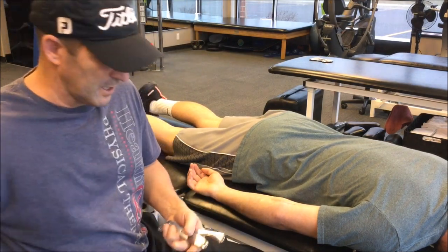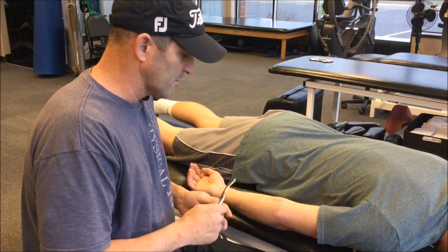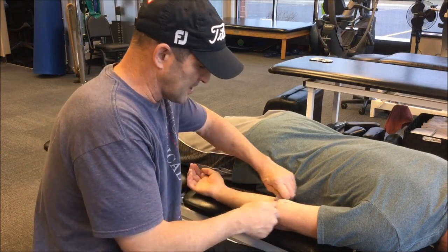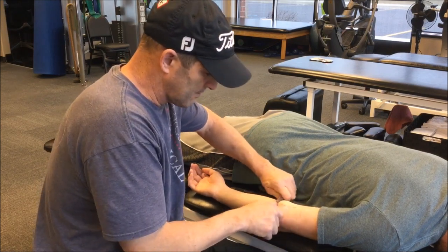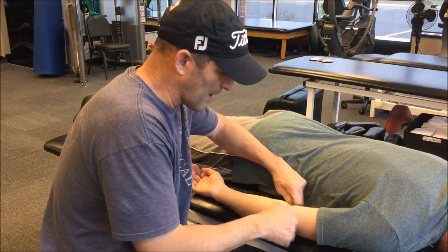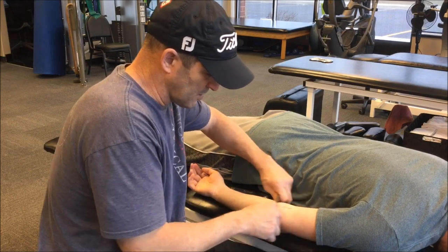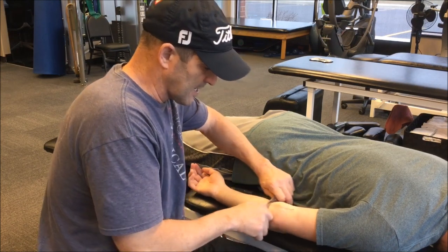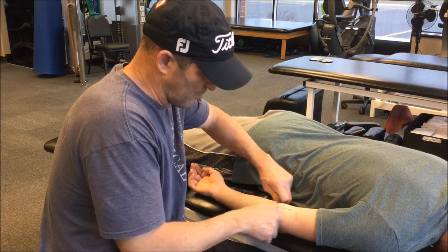Depending on the acuity of the injury, the scar mobility, and what you're trying to accomplish, I'll always start more diffuse. With the contoured Graston tool, I'll take the beveled edge and just start going along the scar lightly to get the athlete used to it, always being careful around bony prominences. The first technique I use is always diffuse, and I gradually start to increase my pressure. Make sure that you're avoiding bony prominences.